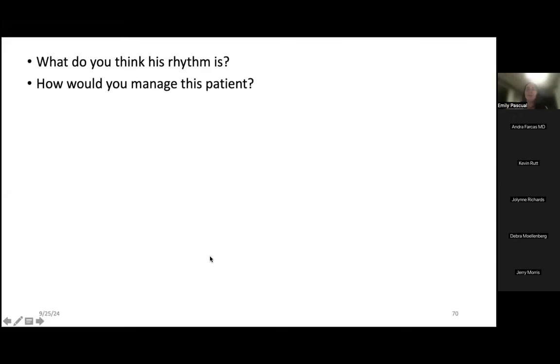Pad IV monitor. Yeah, I think that's definitely a reasonable place to start for sure. Would you guys do amiodarone on this person? That's pretty much the only antiarrhythmic most agencies carry.